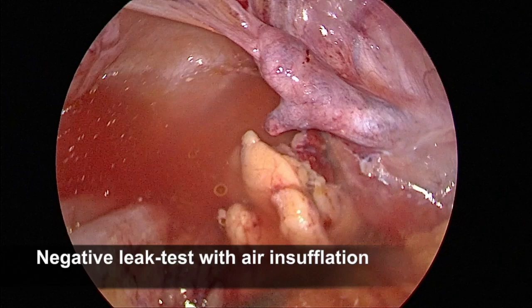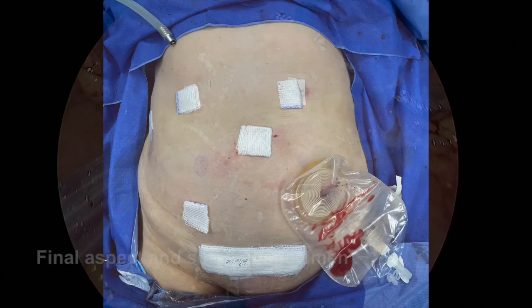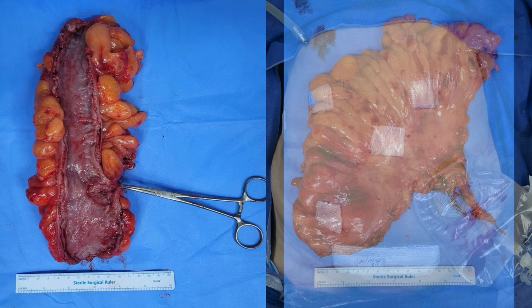We can see the final aspect of the patient and the surgical specimen. The final staging was pT3N1b, showing a moderately differentiated adenocarcinoma, with metastasis in 2 out of 21 dissected lymph nodes.